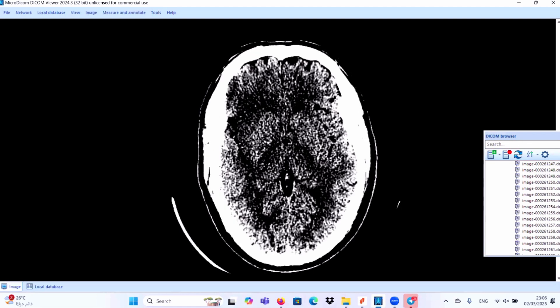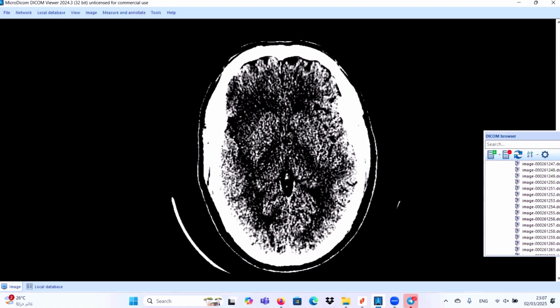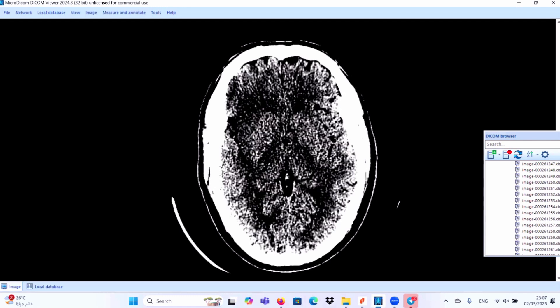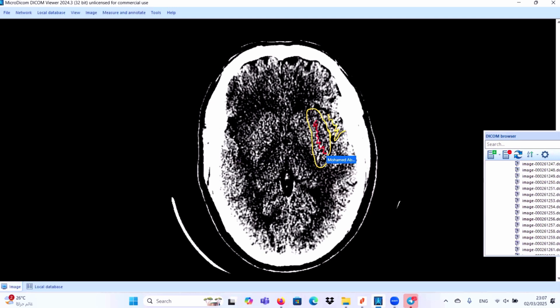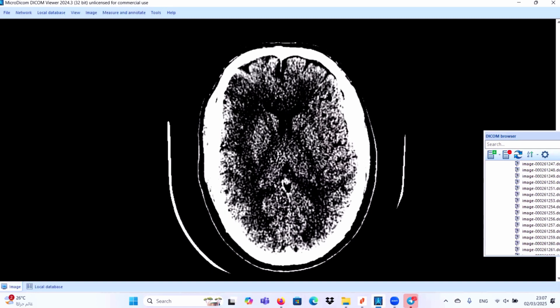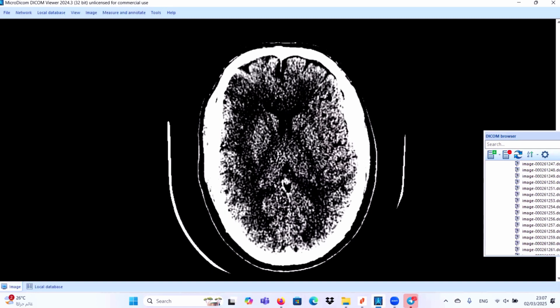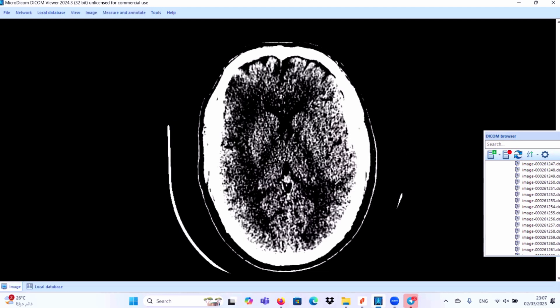And we will search for the other signs for early acute ischemic insult. If you go here, you will find this is the insula, this is the Sylvian fissure, and this is the insula. Look at the insula, this is the normal density. Look at the contralateral side: the insula appears hypodense as compared to the contralateral side. This is called insular ribbon sign.